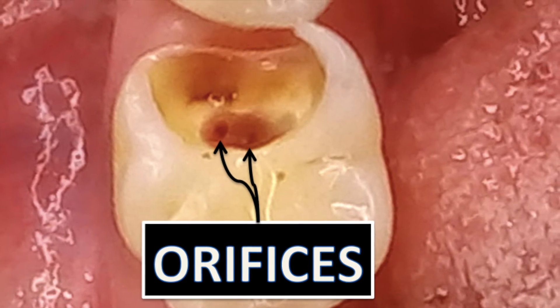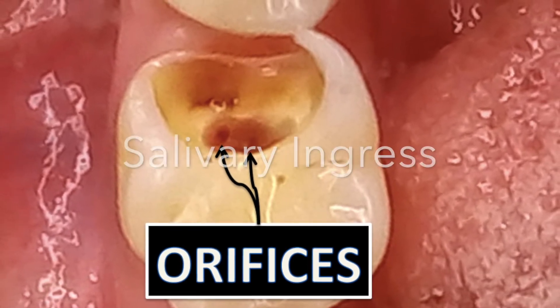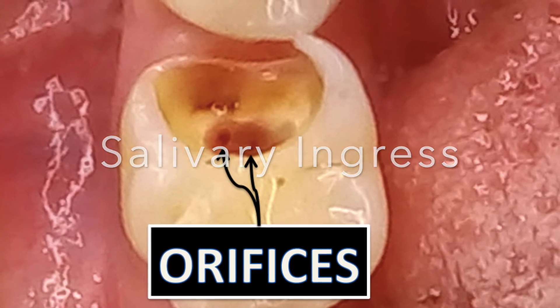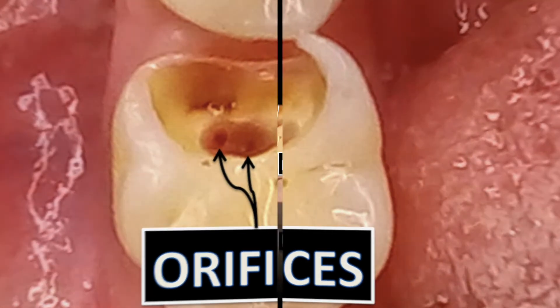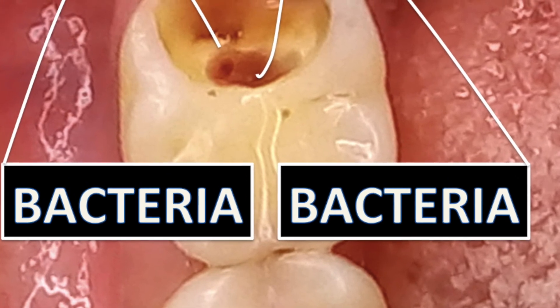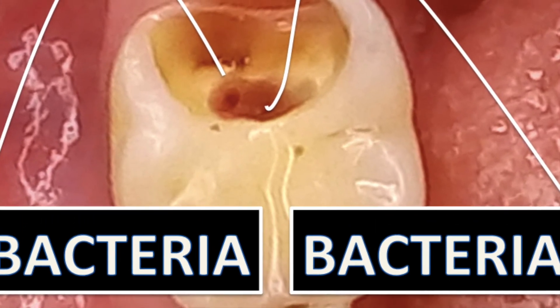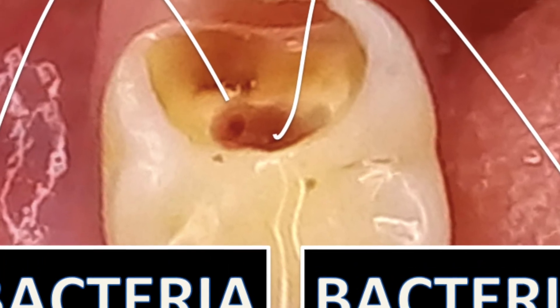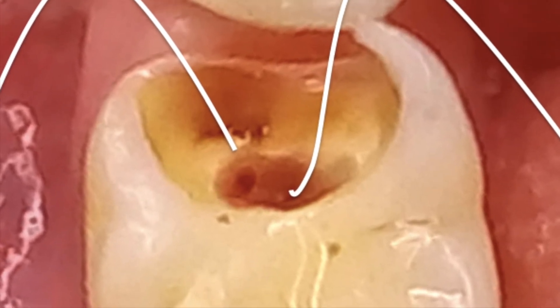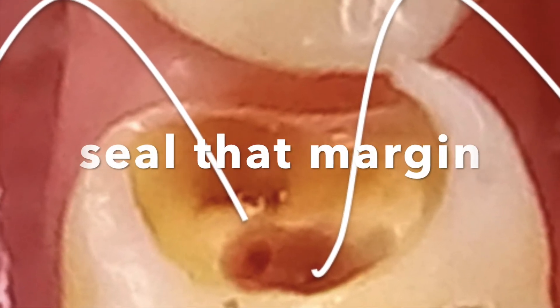Note however that the mesial wall here is open to salivary ingress, and along with it all the bacteria that inhabit the oral cavity. Placing a temporary filling there will not stop the saliva from entering, and a definitive restoration should be placed at this point to seal that margin.